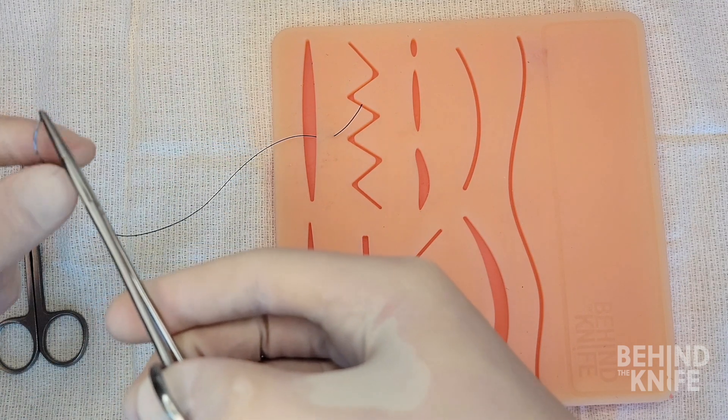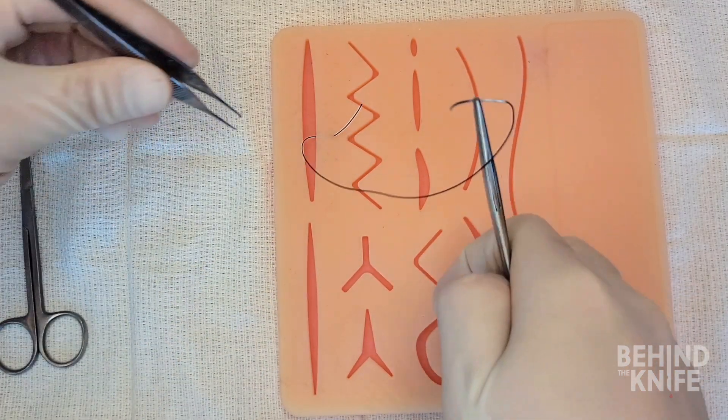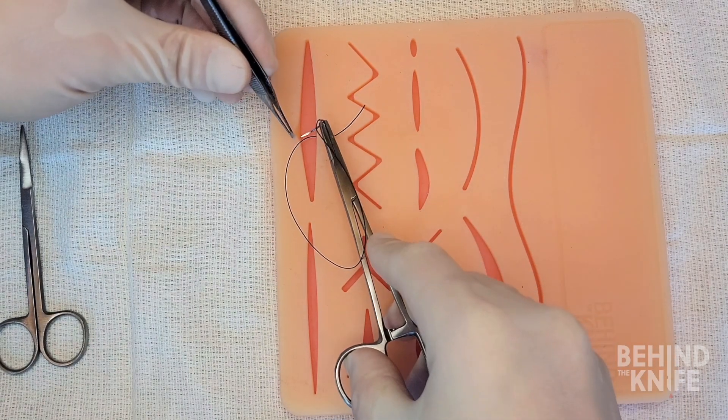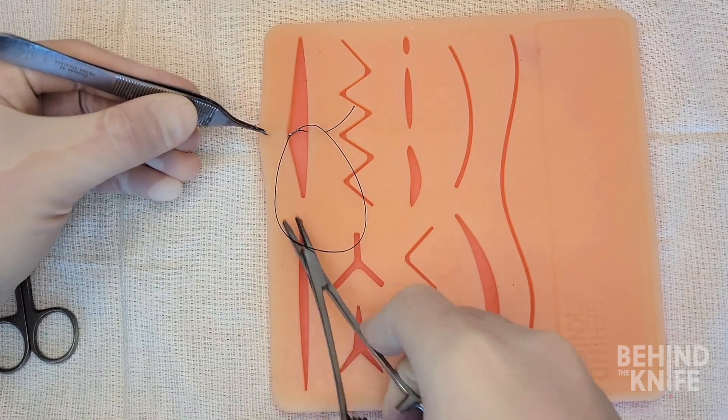The first throw for the suture may be difficult to do in a single bite, so I will take it in two. Going back into the wound here below the dermis and coming out around five to eight millimeters on the other side of the wound.